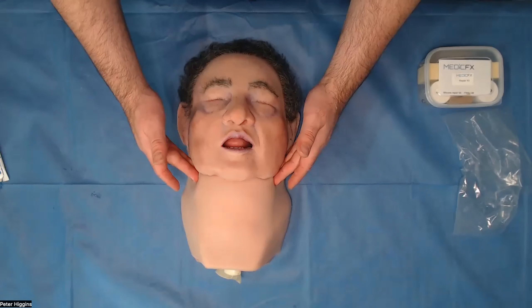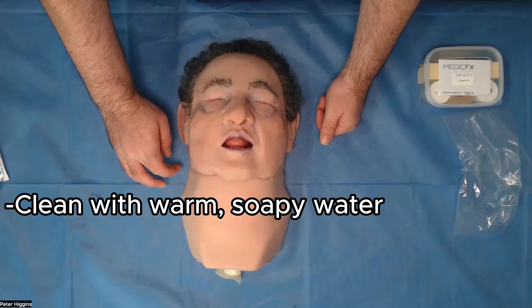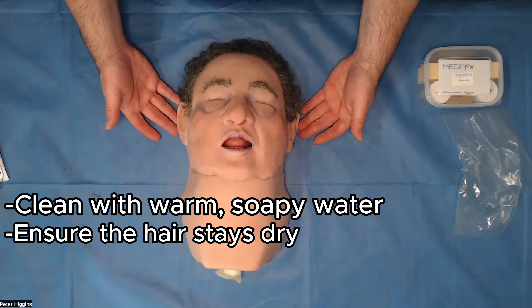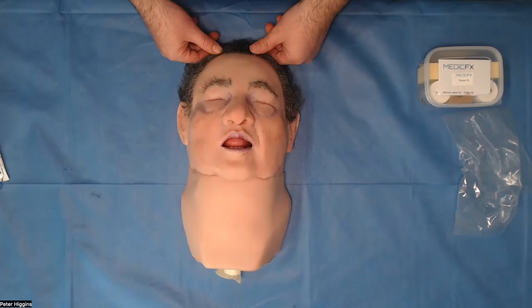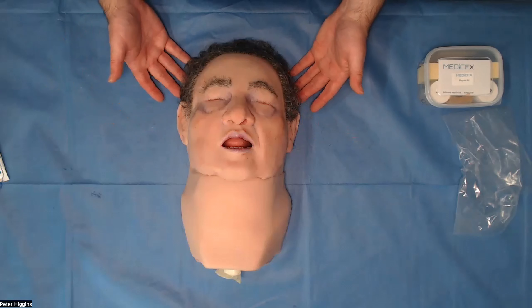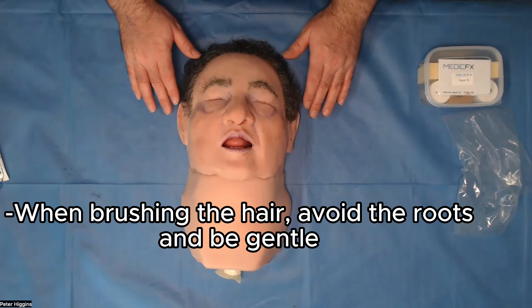With these guys, you are welcome to wash them with warm soapy water. There are no components that can get damaged. However, try and keep the hair as dry as possible when you're doing that. The hair is punched in, so there is a risk of some shedding. If you want to try and maintain the hair, you're welcome to use a brush, but please just try and stay away from the roots if possible.